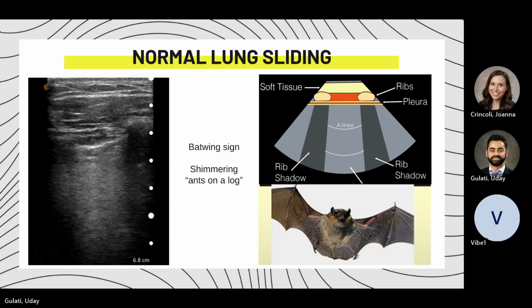So what am I saying by is there lung sliding? I'm taking my probe, usually the linear one or the phased array, so I can fit it between the 2 ribs. And you take that, you find your bone. So what you're seeing is that this shadowing right here is bone, right? Because it's very hypoechoic, meaning that the ultrasound rays are not being able to pass through all that thick calcium, and so you're seeing nothing behind it.